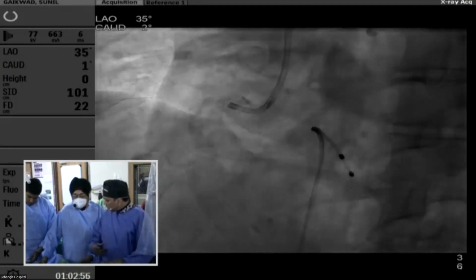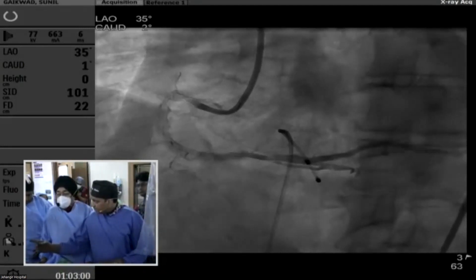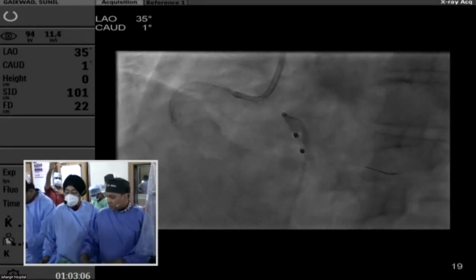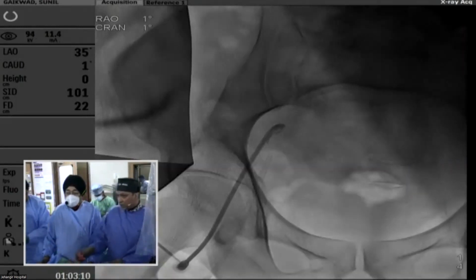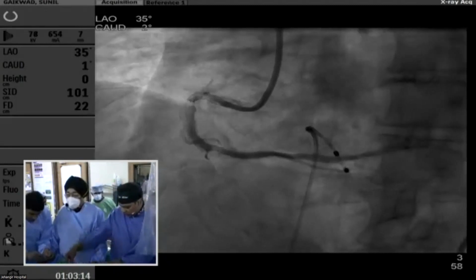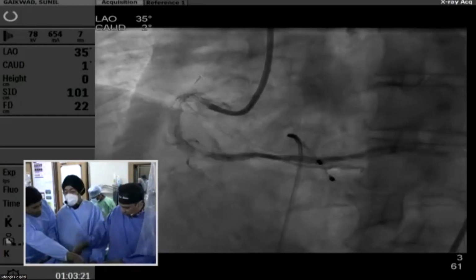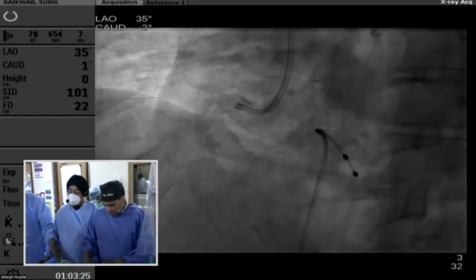Dr. Duggal, you want to add something? As you see, there is dense calcification, and in the angio we thought it was a tram-trail sign. But there were 2 nodules, one in the proximal segment just after the first bend, and the second also showed a nodule. The first was an eruptive nodule, and there are 2 nodules which we'll show you in OCT. We had to take the catheter with a guide liner and pre-dilate with a 2 millimeter balloon before we could take an OCT catheter.